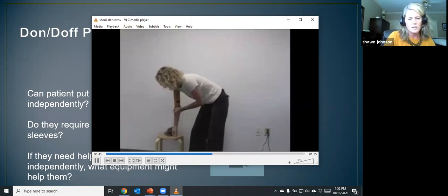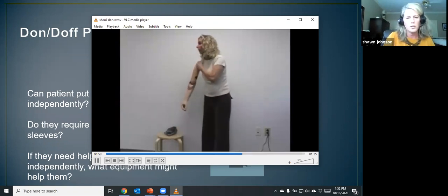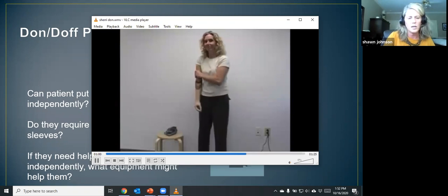But harnesses, she just hadn't worn a prosthesis in so long because they were always so heavy, and she didn't like harnesses. So this was just an attempt to help her take some of the workforce off of her left arm, since it was starting to become overused.